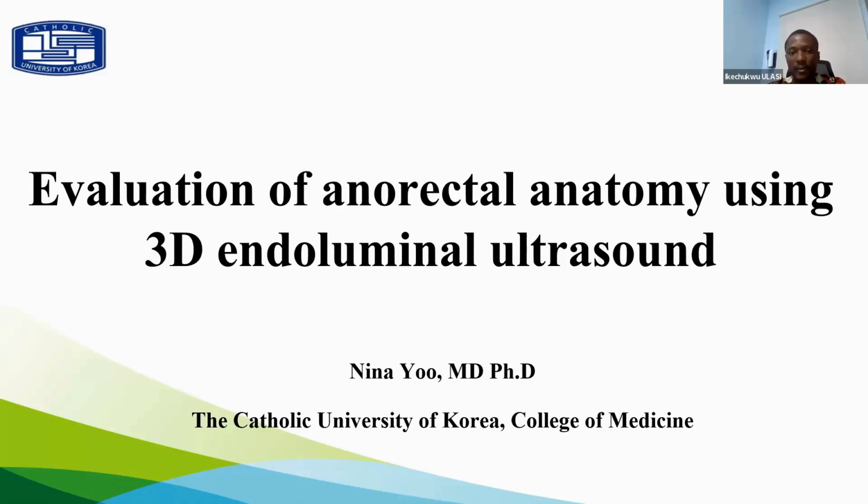Thank you for inviting me as a speaker today. I'm Nina Yoo from the Catholic University of Korea. I am a colorectal surgeon, and I'm really honored to speak about the use of transrectal and transanal ultrasound in anorectal disease and in evaluating the anorectal anatomy today.